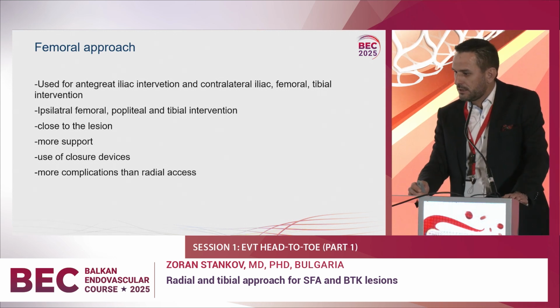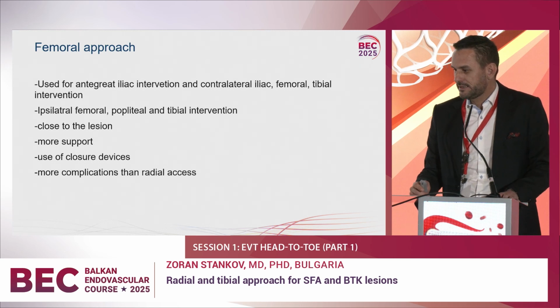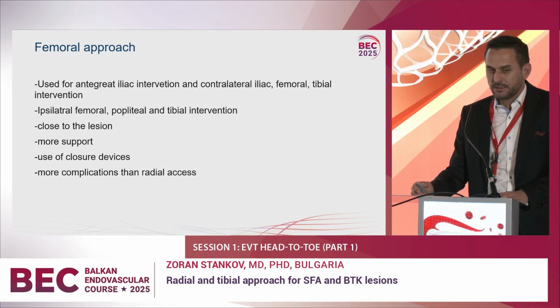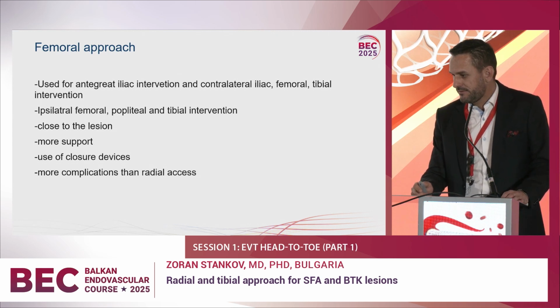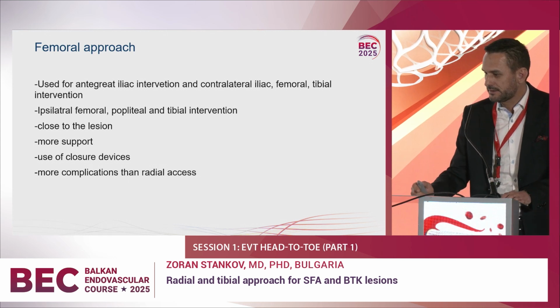Regarding closure devices, the femoral approach is the one with the most closure devices dedicated to it. We can use all of them: Angio-Seal, Manta, Prostyle, everything. They are dedicated for the femoral approach. We use the same devices for other approaches, like the brachial, but it's off-label. For carotid, using a closure device is still off-label.